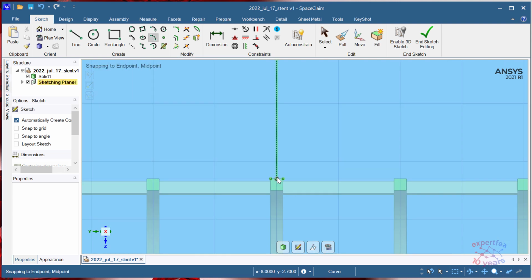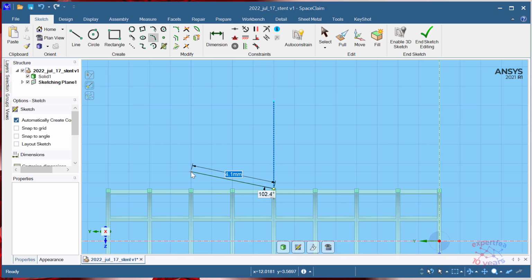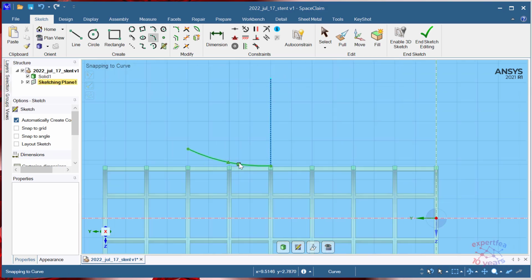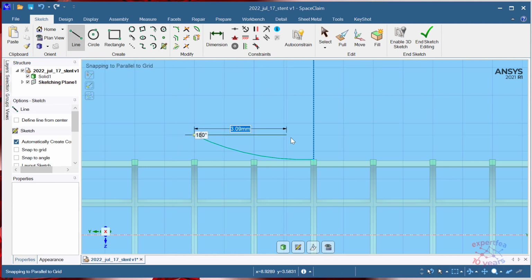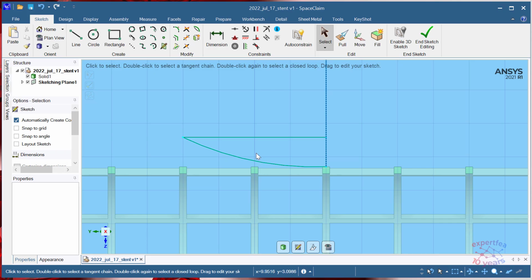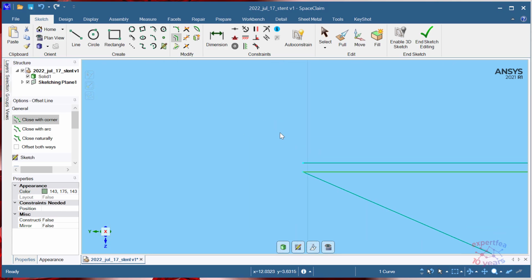So 3-point arc, we're going somewhere, let's not exactly touch this strut. And have something like this. What remains is to go here. So this is half of the plaque, let's say. Then the blood vessel would be something like, we'll offset here. This edge will offset with 0.01. Then we will extend this.